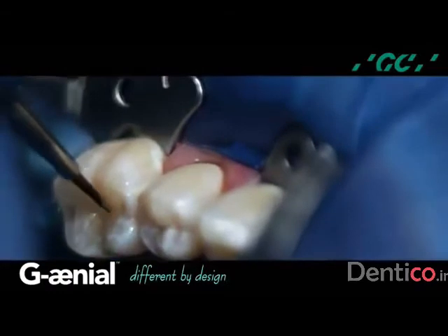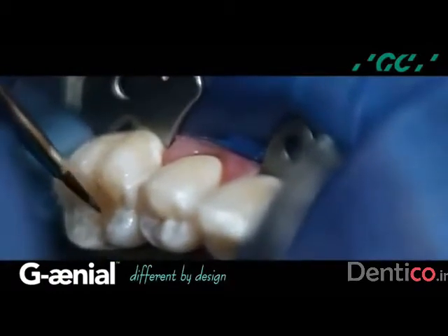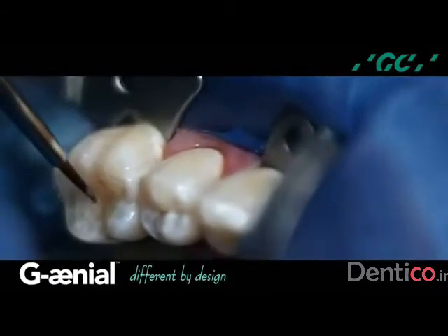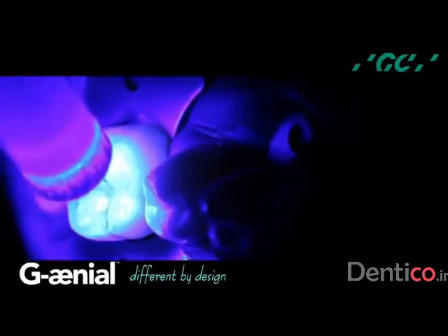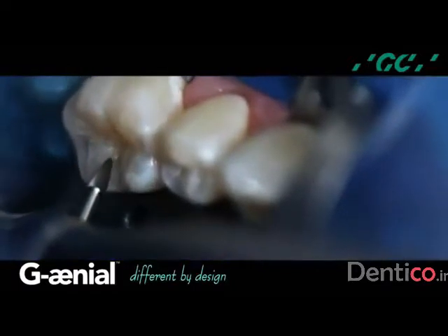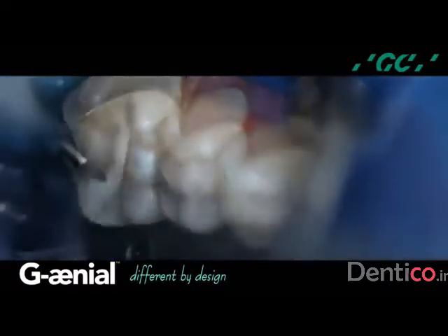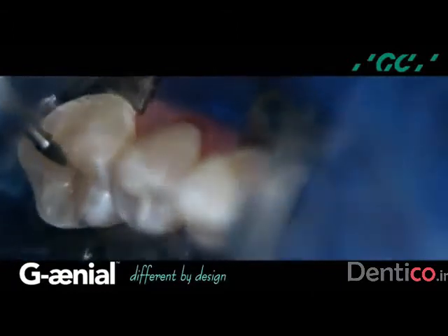A final enamel layer of AE shaded Genial Universal Flow is applied over the entire dentin layer, maintaining the anatomical morphological contours, and a final 2-minute post-cure which increases the hardness. Finishing is accomplished with a 30-fluted H274 tapered finishing bur by Brasseler. Notice the shape follows the occlusal anatomical contours.